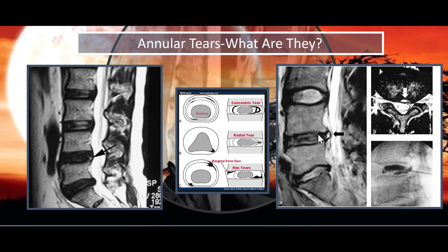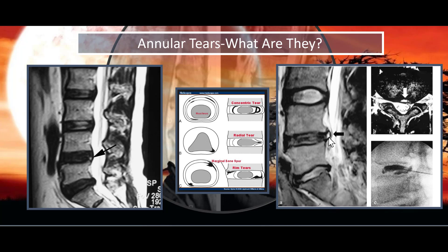Moving down to the disc below it, you'll notice that the disc is darker — that is called desiccation. What I want you to recognize is in the back where my white arrow is, right here where this black arrow is, notice that bright white spot. That is considered an annular tear, and you can see it here also. That bright white spot in the outer part of the disc, or the periphery of the disc, is generally the area that has the majority of nerve fibers, making it capable of transmitting pain.